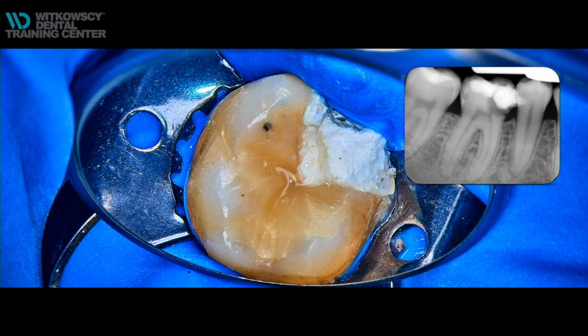If we look carefully at the distal aspect, then we will understand the anatomy. Well, the main problem with endodontic treatments is misunderstanding the anatomy. If you misunderstand the anatomy, if you fail with judgment of this anatomy, then you will fail with your treatment. So let's come back to the case.